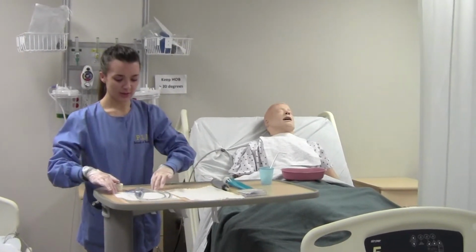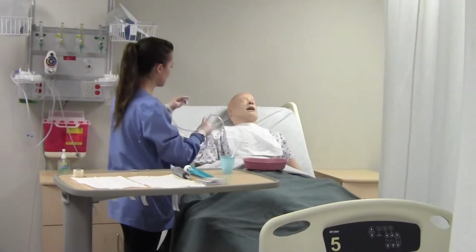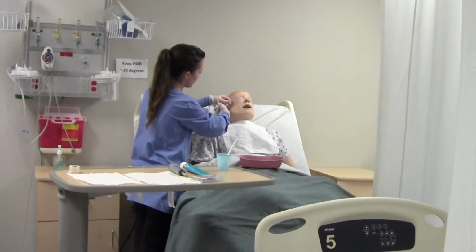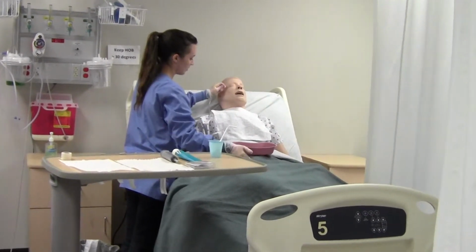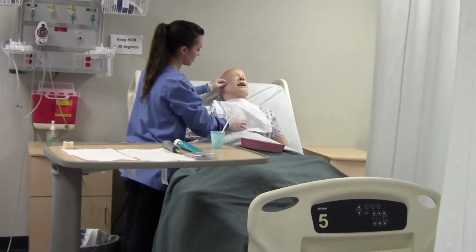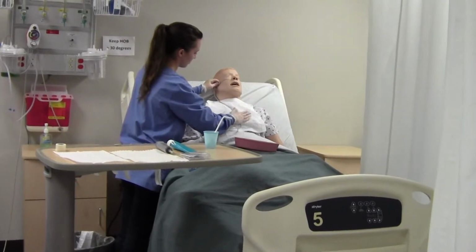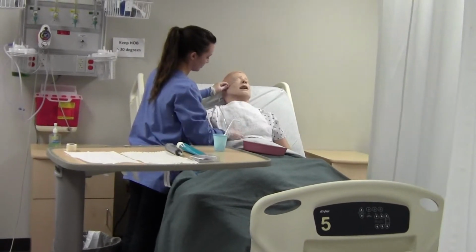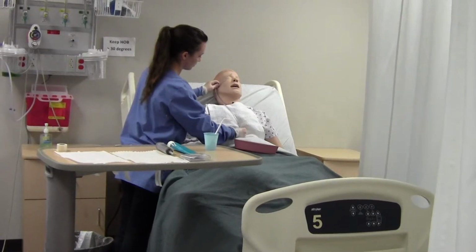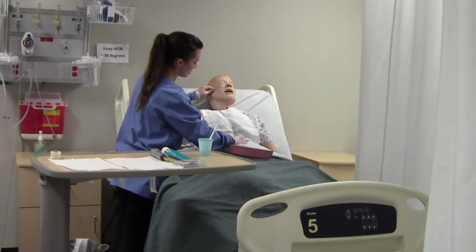Okay, perfect. So what I'm going to do first is I'm going to measure it. And how I'm going to do that, Mr. Templeton, is I'm going to go from your nasal passageways to your earlobe, to your xiphoid process, which is in your sternum, which is around right here. Feel for it. So it's about right here. So you have your nasal to your earlobe to your xiphoid process.